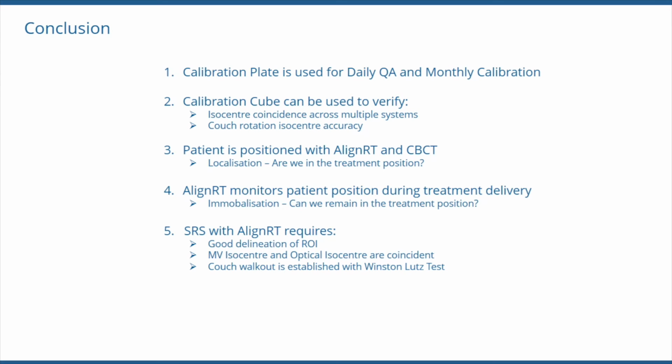SRS with AlignRT requires a good delineation of the ROI to ensure the system can track the surface accurately. We need to be sure the MV isocenter and optical isocenter are coincident, and when performing couch rotations during treatment, the couch walkout has been established using a Winston-Lutz test and AlignRT.